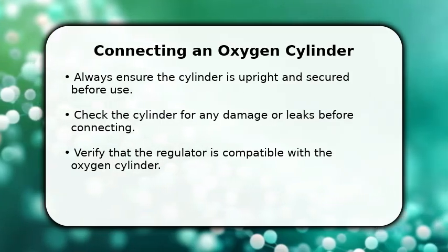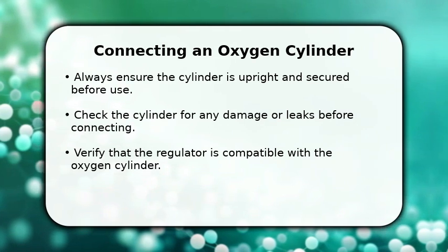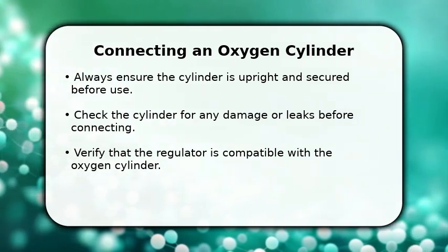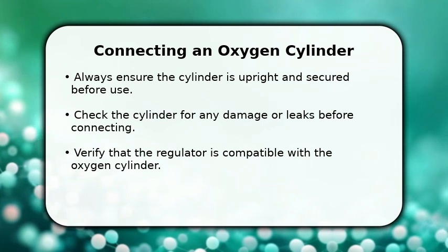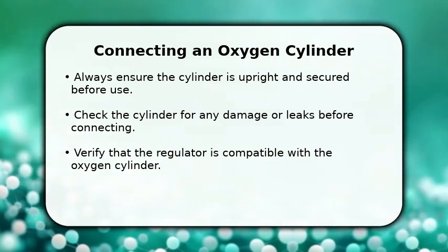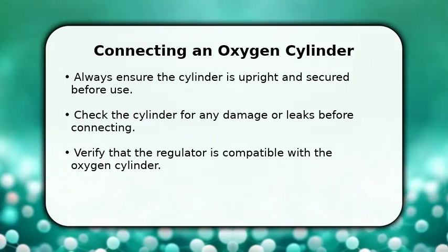In this video, I will show how to connect an oxygen cylinder. First, always prioritize safety. Make sure your oxygen cylinder is secured upright to prevent it from falling over. Before you begin, visually inspect the cylinder for any signs of damage or leaks. Also, confirm that your regulator is specifically designed for oxygen and is compatible with the cylinder's valve type. This initial check takes only a few moments, but is crucial for safe operation.